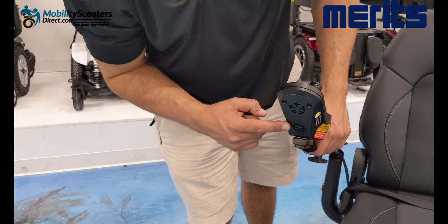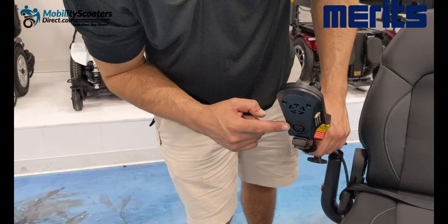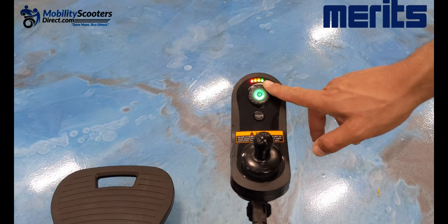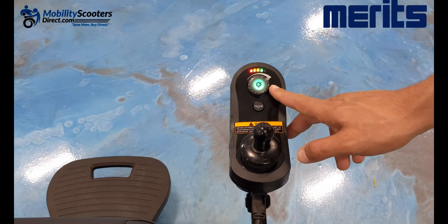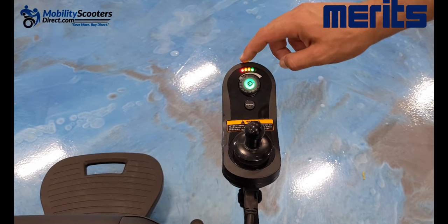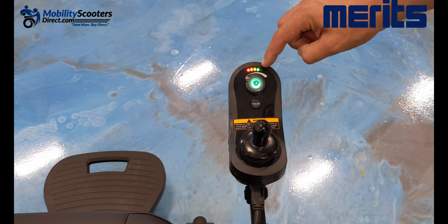On the base you'll see a small port for the XLR charger that came with the power wheelchair. When you first get your chair, we recommend charging it overnight; after that, depending on how low the batteries are, it usually takes about four to six hours to charge. The speed control knob is also here — all the way clockwise makes it go fast, all the way counterclockwise makes it go slow. The lights above that knob indicate the battery level.